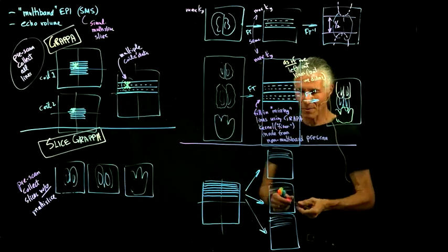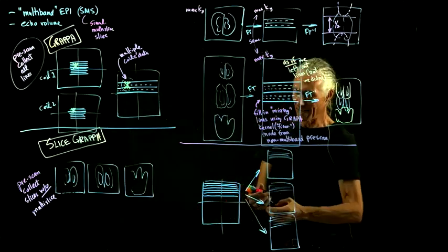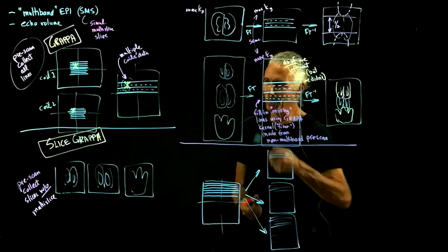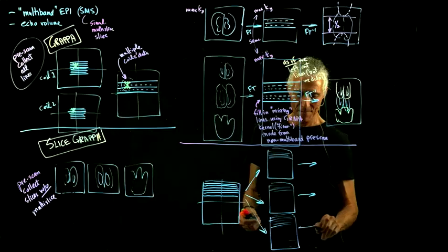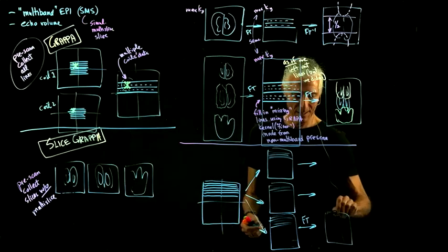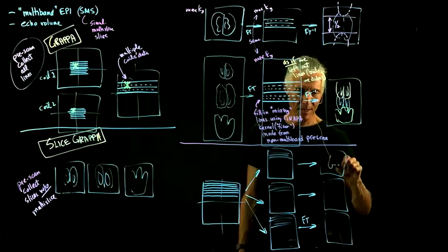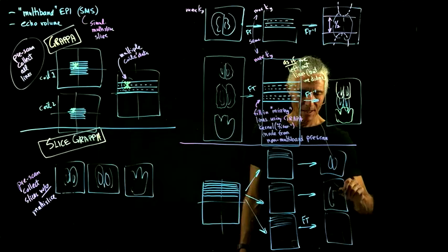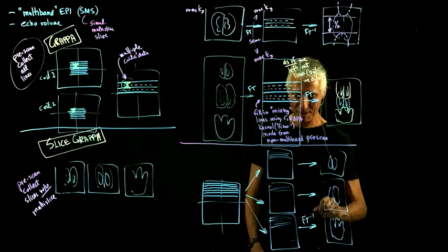Okay, so now that we've essentially generated 3 k-spaces out of our 1 k-space using our little filler-inner, then we can just Fourier transform those, ft minus 1, and get our separate slices. So then we can get our full slices completely separated. So that's ft minus 1.